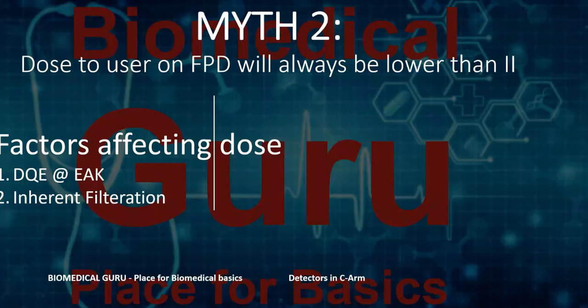So the job of a good C-arm is to reduce the quantity of soft X-rays, and it is done by giving a better filtration. So the filtration is generally measured in aluminum equivalent thickness. Thicker the aluminum filter, more will be the filtration and less will be the scattered dose on the patient. So here the EAK or the DQE will remain the same, but because the filter is thicker, you can find the overall scattered dose will be lesser in some machines which have better aluminum filtration.